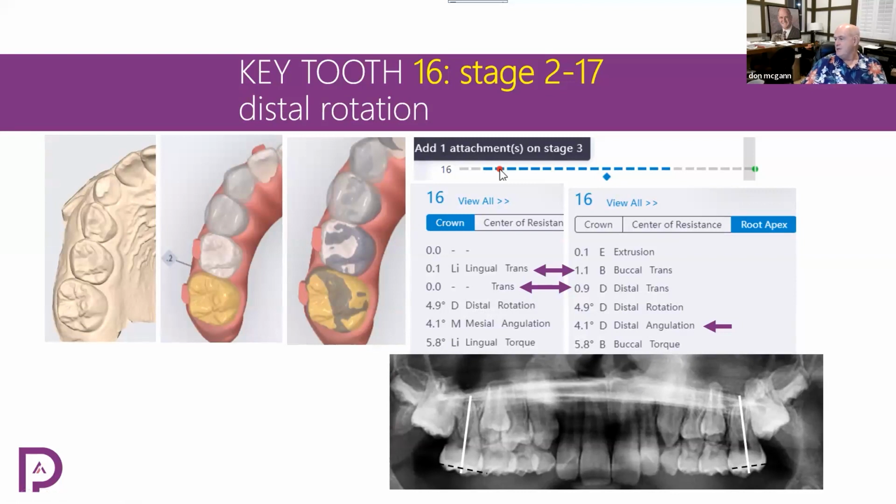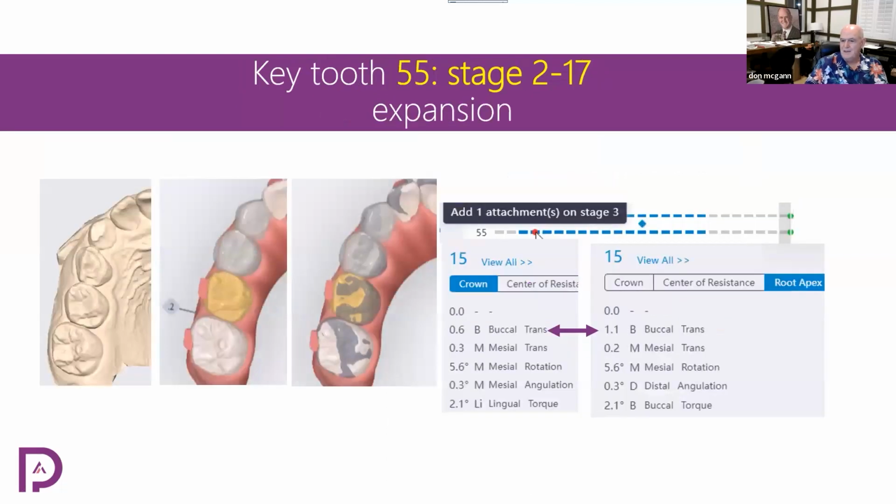See, these upper molars are not mesial inclined. So if I put the upper root into the 7 there, and the 8 is also in its way, I don't know if that is going to happen, but it's only a millimeter at the apex. The crown is not going back. There's no distalization. If you wanted to distalize this, seriously, you'd either take out the 7 or the 8 at least, and then you could distalize. But on these young kids, nobody wants to be taking out upper 8s and 7s. But I can tell you we have a lot of upper 7 cases, and they work great with the aligners. The aligner is the preferred appliance if you're going to distalize.